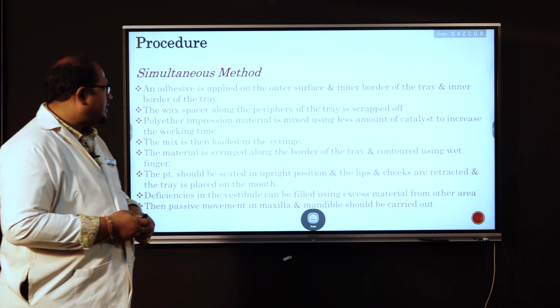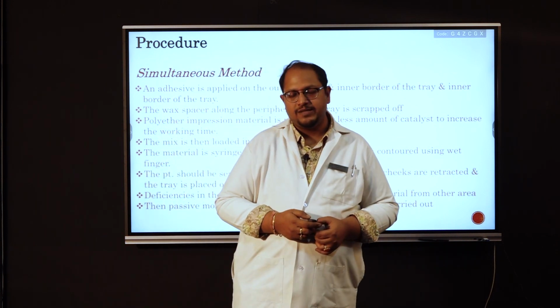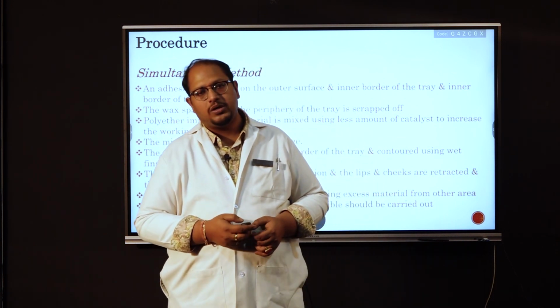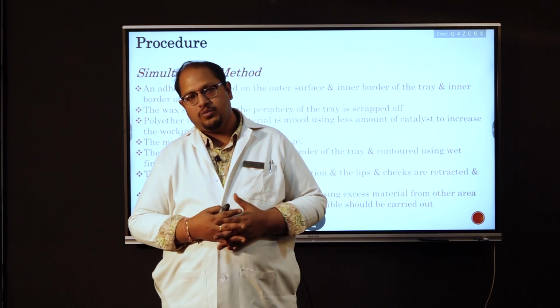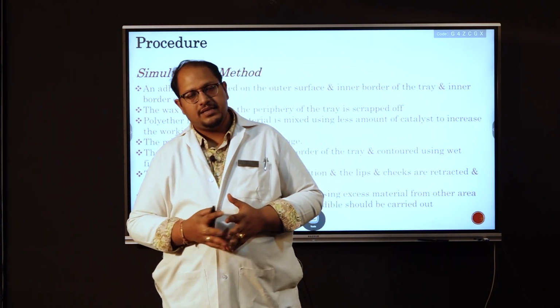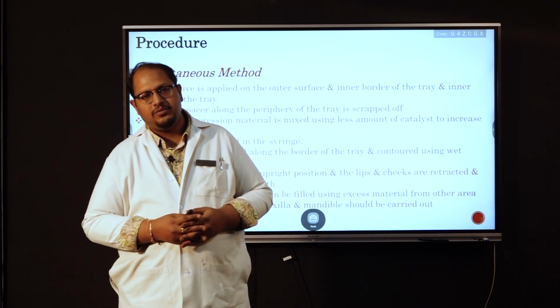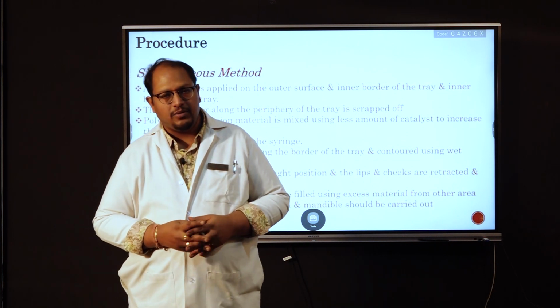Now, there are other methods that we use. When we spoke about the different types of border molding, there are 2 types: incremental border molding and single step border molding. Till now, what we have studied was the incremental border molding technique.